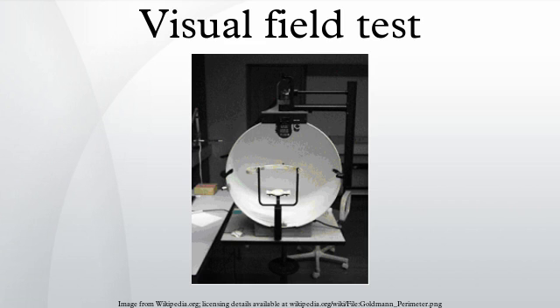Exam methods. Here is a list of techniques used to perform this test. Confrontation visual field exam. The examiner will ask the patient to cover one eye and stare at the examiner. Ideally, when the patient covers their right eye, the examiner covers their left eye, and vice versa. The examiner will then move his hand out of the patient's visual field and then bring it back in. Commonly the examiner will use a slowly wagging finger or a hat pin for this. The patient signals the examiner when his hand comes back into view. This is frequently done by an examiner as a simple and preliminary test.